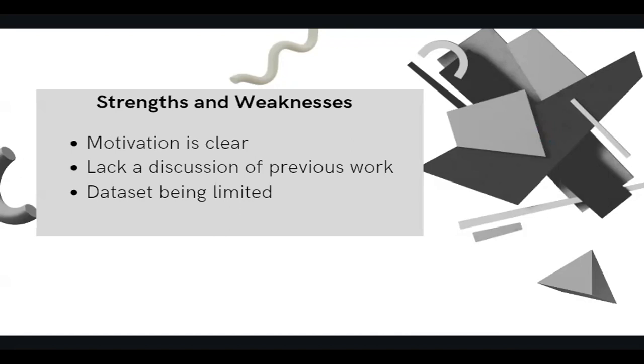As discussed previously, the data set is very limited and small, and there's not much variety in the pregnant people's race, ethnicity, and nationality. What that means is there's not a lot of variety in people's medical history or lifestyle. So we're not really sure how BabyNet would react to something like that. For this reason, I gave this paper a 4 on the NIPS reviewing scale. I'd probably lean towards rejecting this study right now because there's a lack of testing. I do think it's important for the health of pregnant people, but it could pose a problem if not tested on different races, ethnicities, and nationalities.